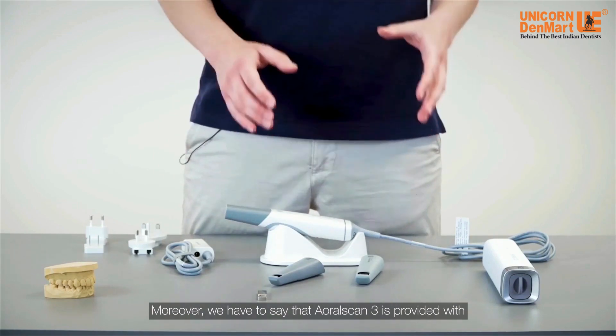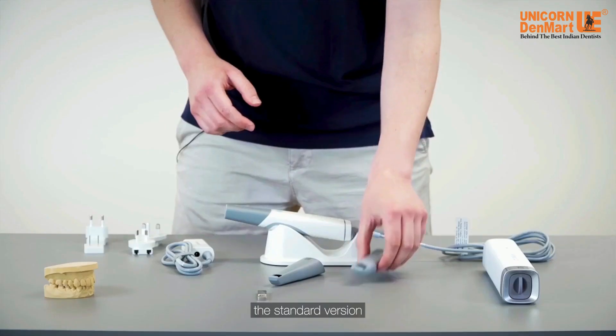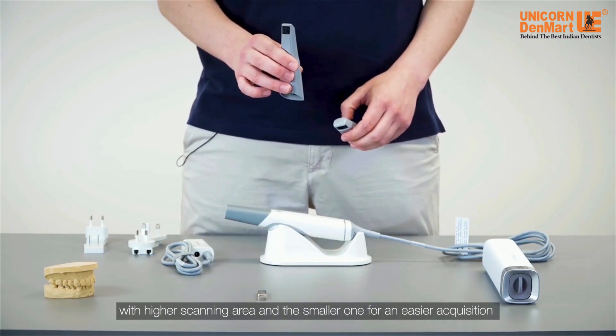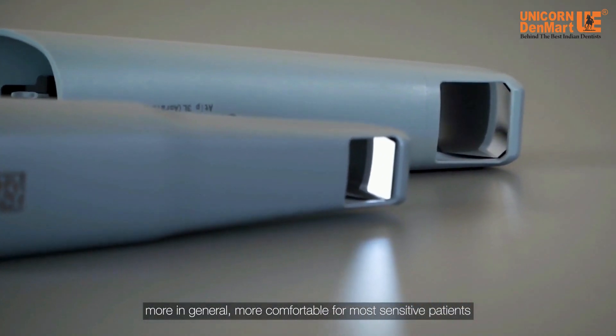Moreover, Aural Scan 3 is provided with five scan tips included in the box with two different sizes: the standard version with a higher scanning area, and the smaller one for an easier acquisition on the posterior teeth, or in general, more comfortable for most sensitive patients.